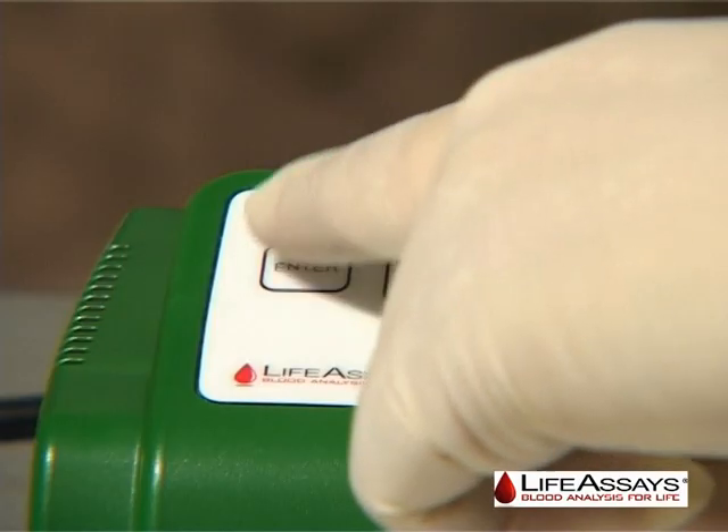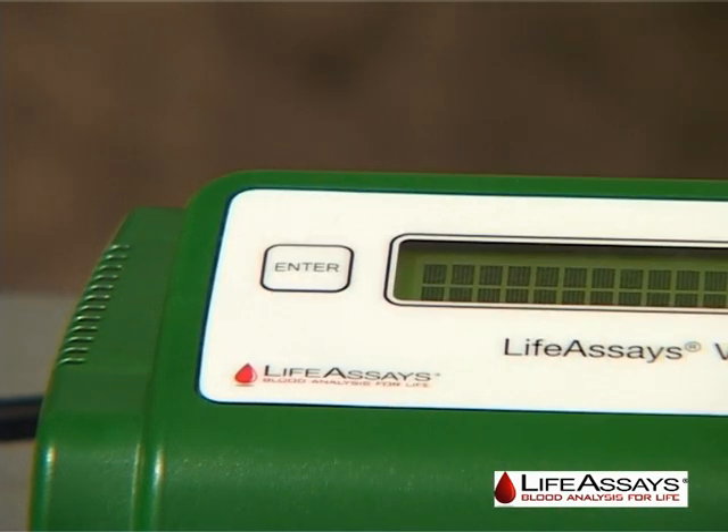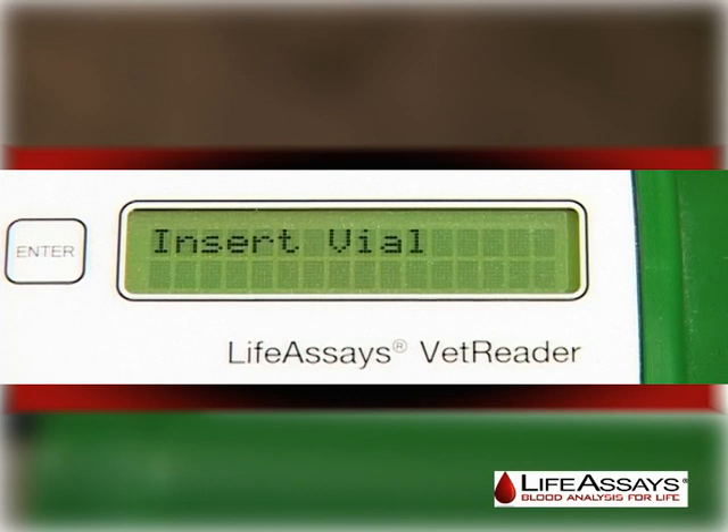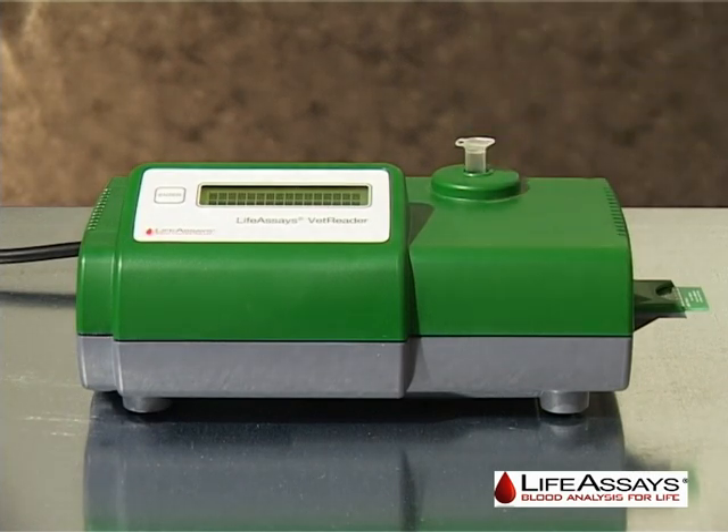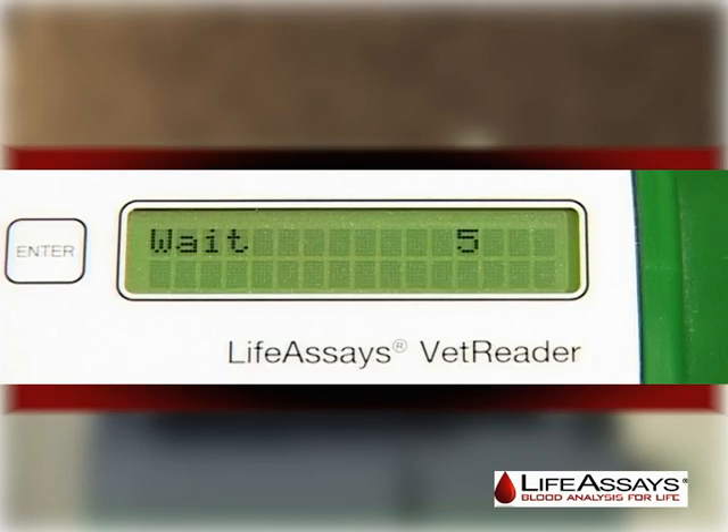To start a measurement, press and hold the enter button. The instrument will display wait followed by insert vial. Load a reagent vial into the VetReader. The instrument will display wait 5 and countdown 5 seconds before displaying collect and add sample.